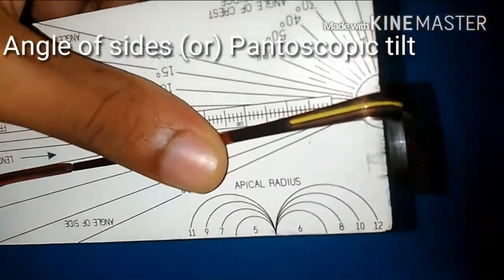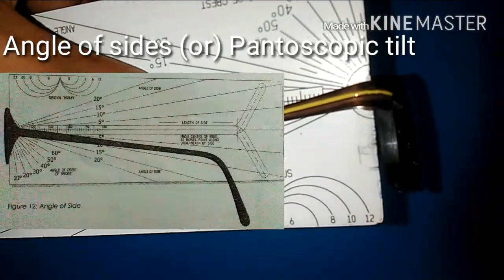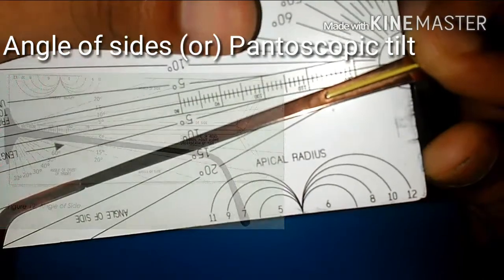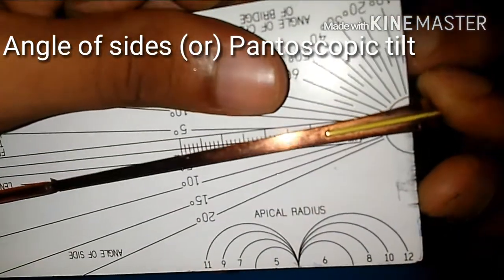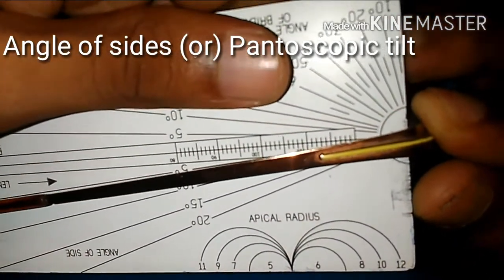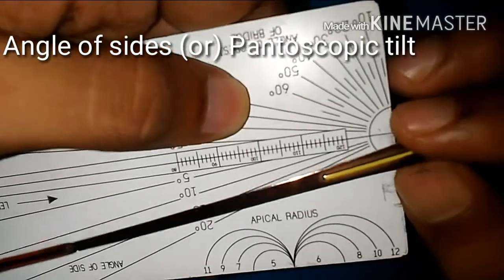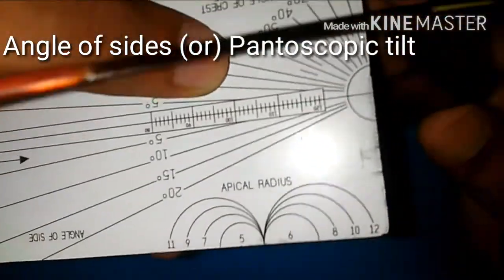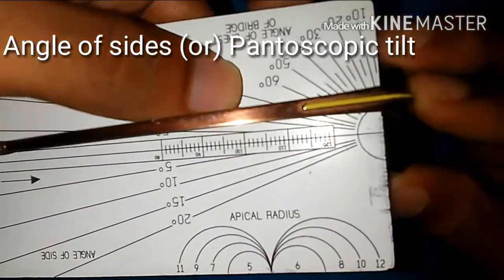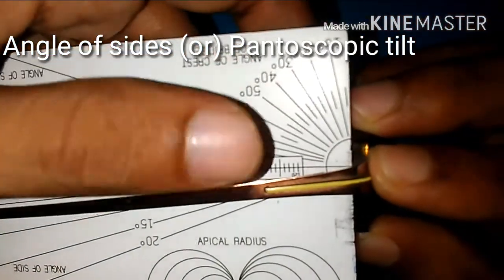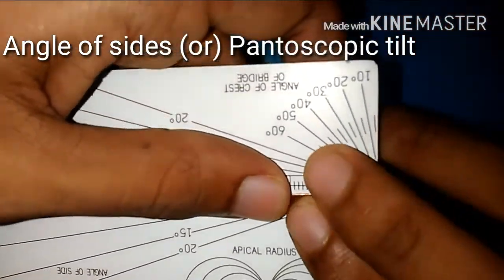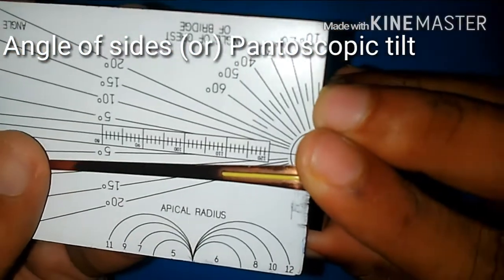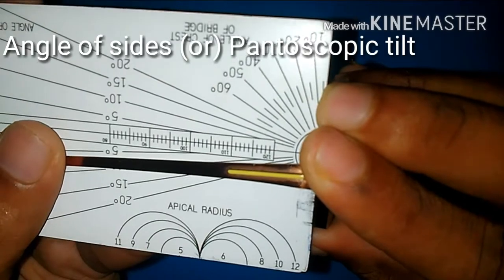The angle of sides is the angle between the back surface of the front plane and the inclination of the sides. To measure that, place the mid of the sides along the vertical line, and the front of the frame along the sides of the ruler, and measure the angle. For this frame it's around 5 degrees.